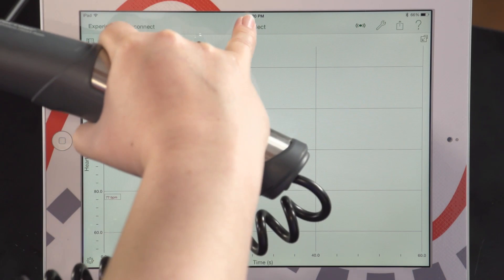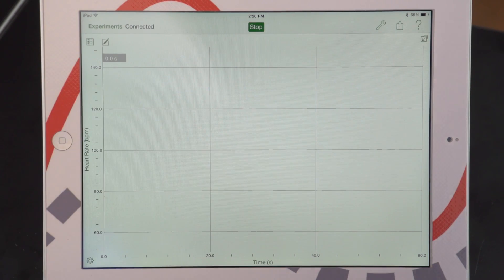So now we're ready to collect data. I'm going to press Collect, and I'm going to collect data for about 15 to 30 seconds at a resting rate in order to get a baseline to compare to any sort of cardiovascular activity I do.